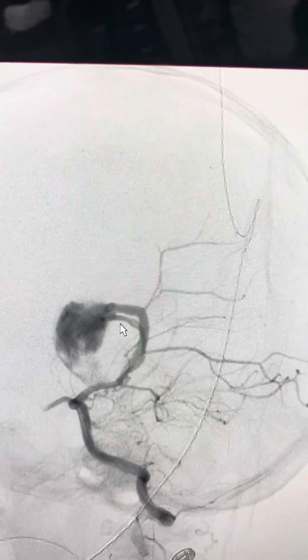So we usually would go with a microcatheter and try to do embolization with high concentration embolic material. Sometimes you need to do more than one injection to control it with the high concentration until you're able to achieve full embolization. So this is the initial one, and we built some embolic material.